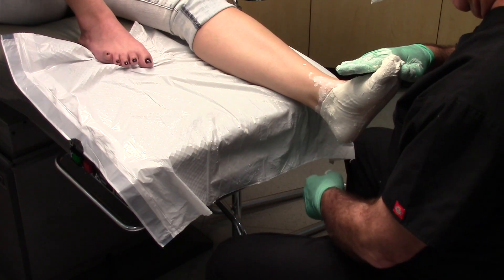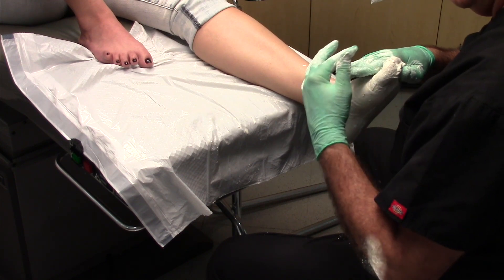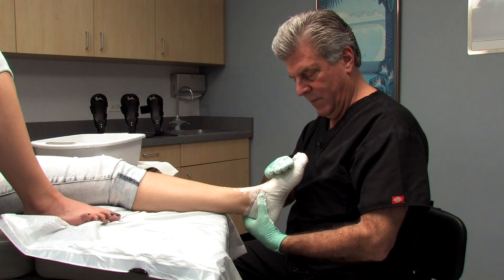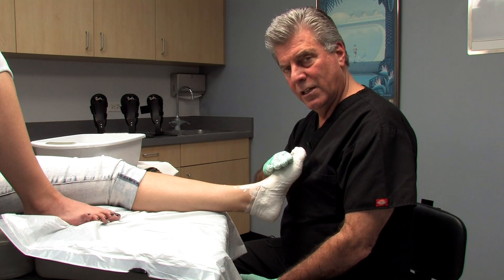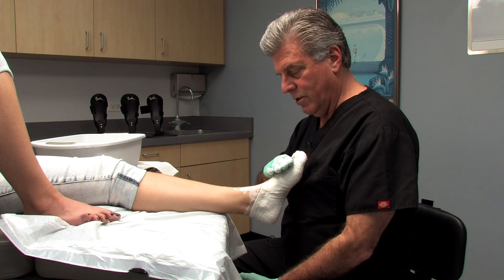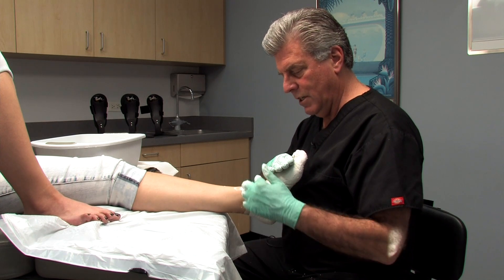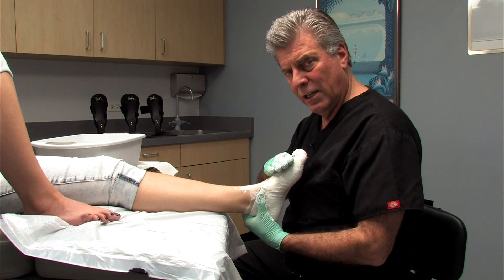Some mistakes practitioners make include grabbing across to digits two and three, which may inadvertently supinate the forefoot. The other common error is simply not lifting hard enough to adequately lock the mid-tarsal joint. A good way to test yourself during the curing process is to occasionally lift the foot — if the leg comes with the foot and there's no excessive motion in the ankle, you're locking it properly. If there is excessive motion, you're not locking the foot correctly.